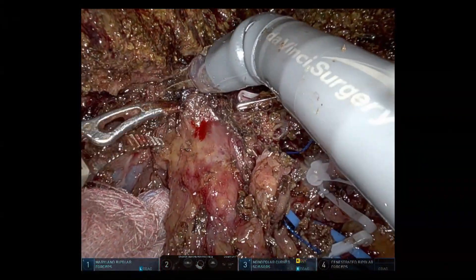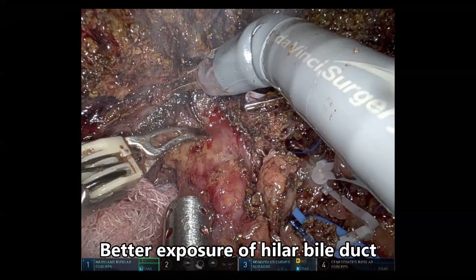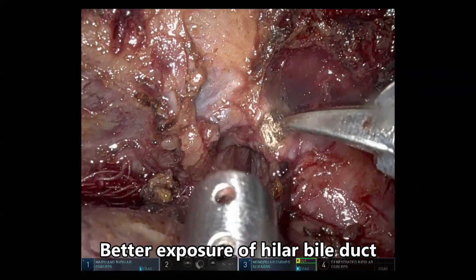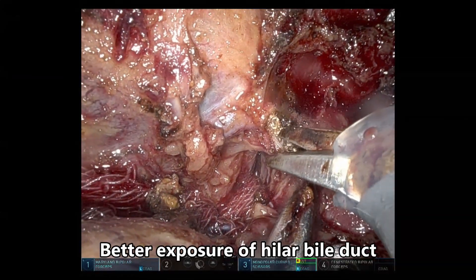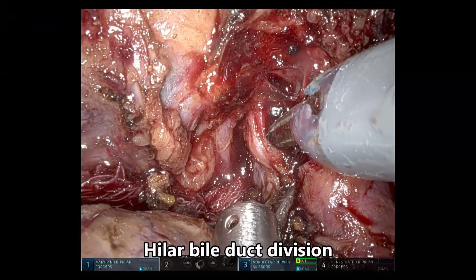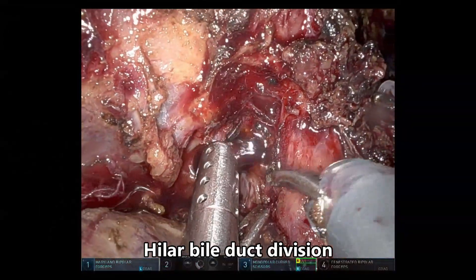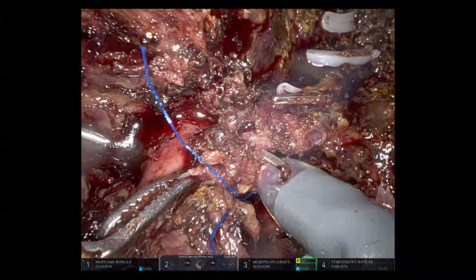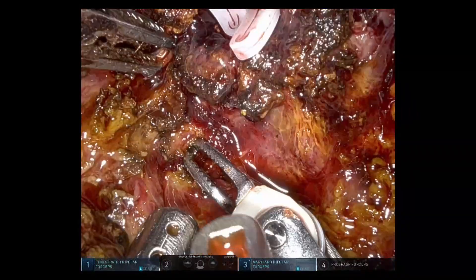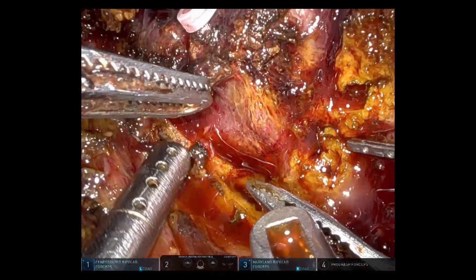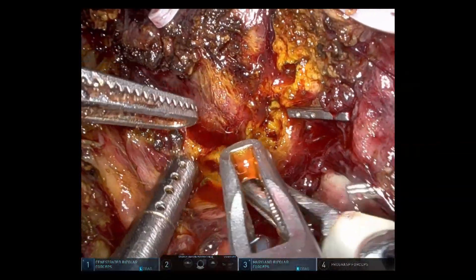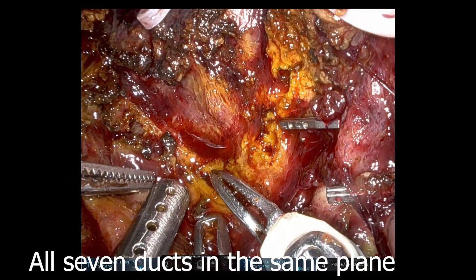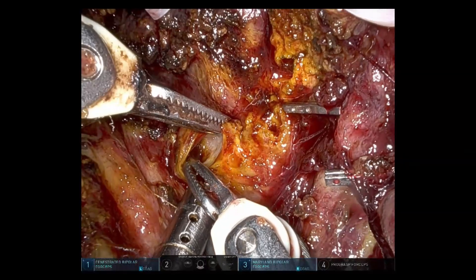Now we can observe that we are having better exposure of the hilar bile duct after liver resection. The division is being performed at the level of segmental bile ducts. After resection, we can observe the multiple segmental bile ducts. However, all 7 ducts are in the same plane. This is the important principle of hilar bile duct resection.